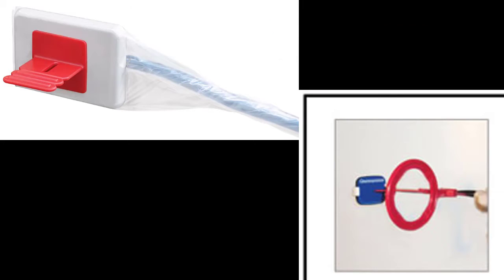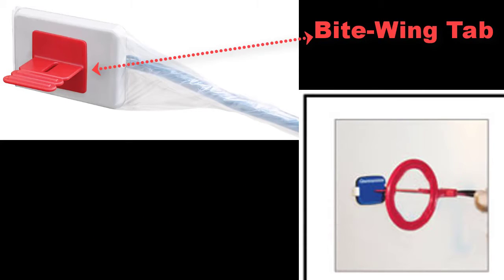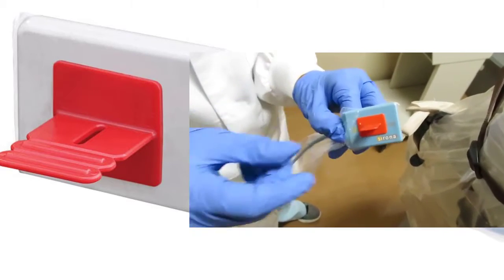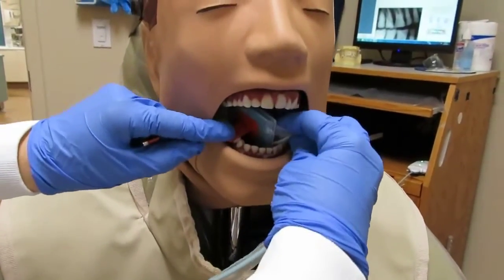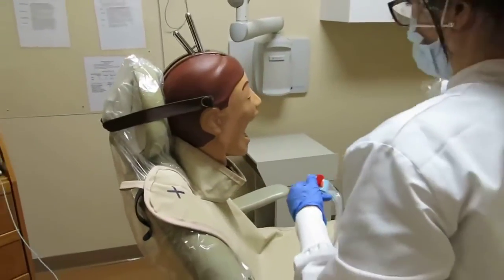Horizontal bitewings can be taken with either a beam alignment device or bitewing tabs. In this video, we will use the regular bitewing tabs. These tabs are attached to the center and the flat side of the receptor. The receptor should be inserted into the patient's mouth between the tongue and the teeth. We will begin with the premolar image.